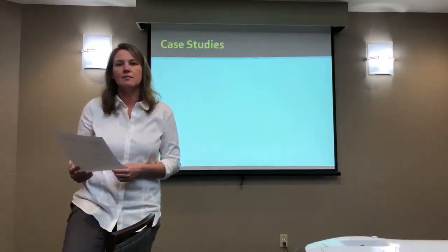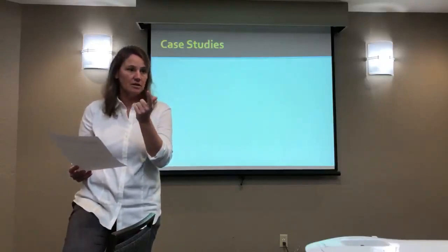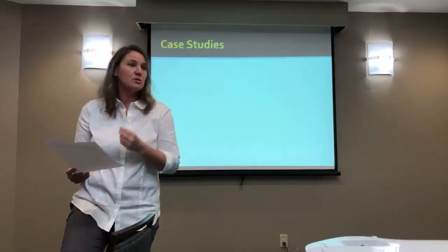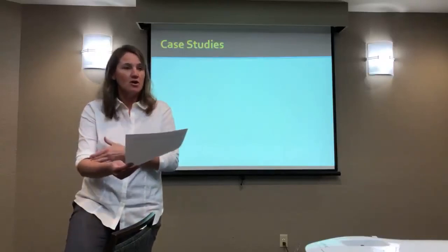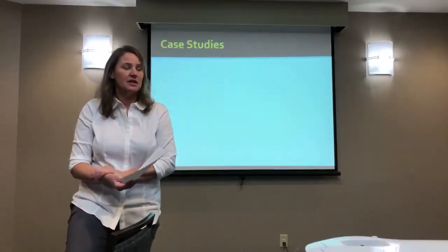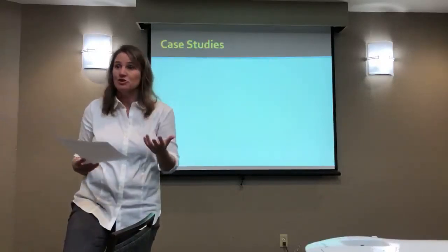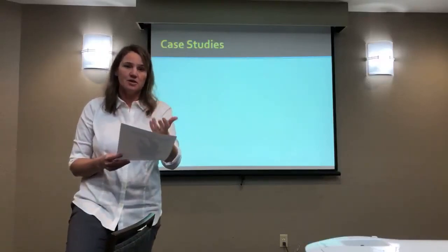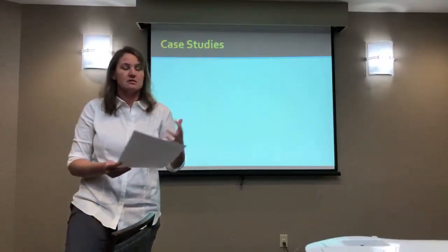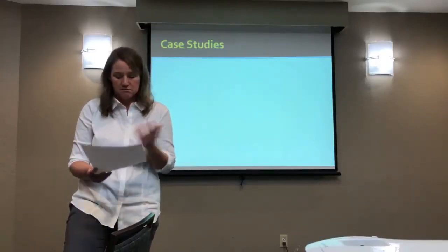So, all things the same, would you keep it all the same? 3 megahertz? Yes. We would use continuous, agreed? Would you keep the 0.5 the same? Might go to one. I might. Depending on the size of the person, if it was my arm versus a man who has a very large muscle, I would definitely alter the intensity. A big thing that's gonna come into play is your technique too. You'll see it when you start doing your lab, my technique might vary how much intensity you're getting. But I would very likely increase to 1 watt per centimeter squared versus 0.5 if the person has a larger amount of muscle tissue.